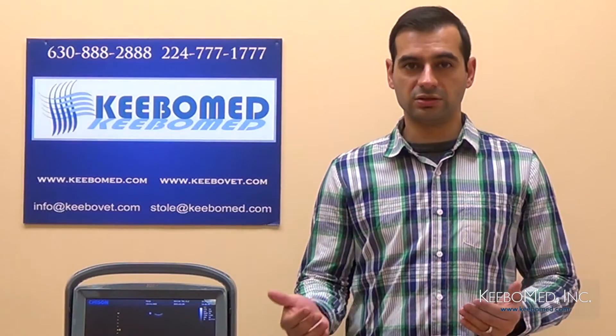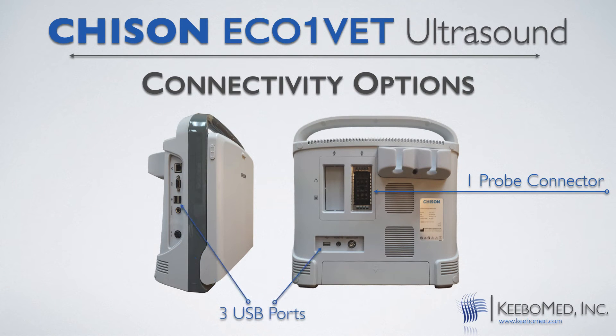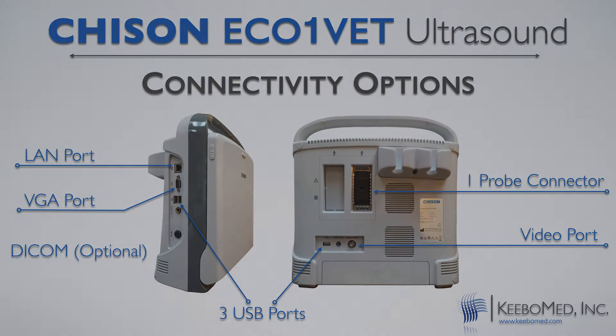Now let's consider the connectivity options of the EcoOne Vet. It comes with one probe connector standard, but two of them are optional. It also has three USB ports, which make this model very unique, because most ultrasounds have only one or two USB ports. Other ports include a VGA port, a video port, a LAN port, and a DICOM port is also an optional feature.